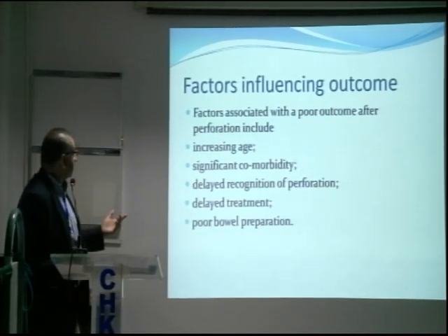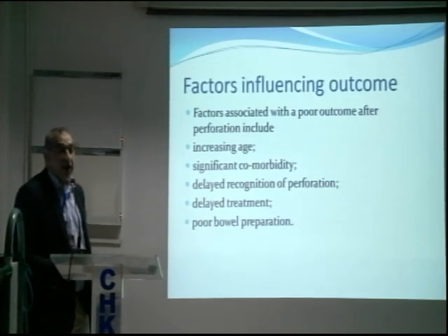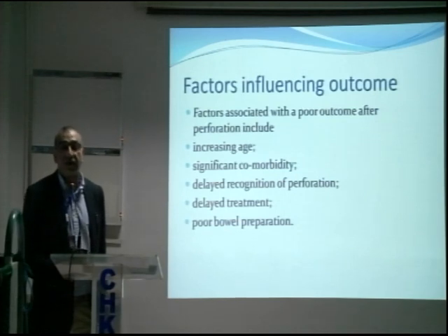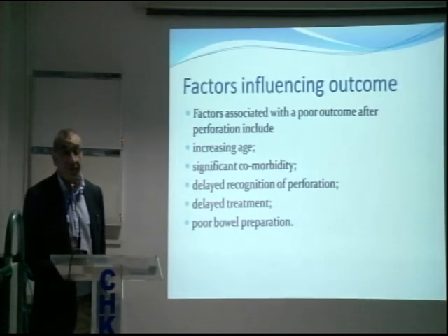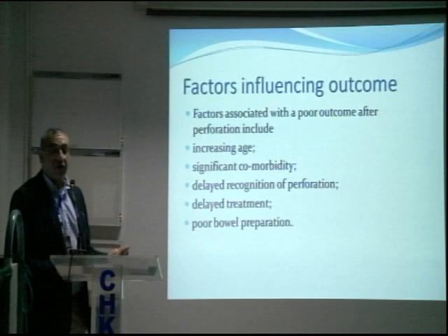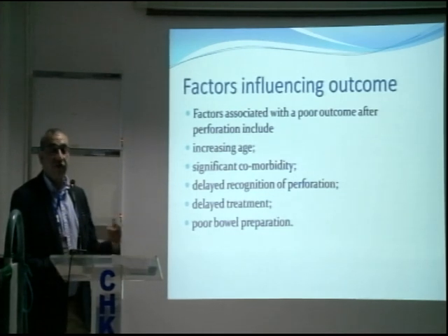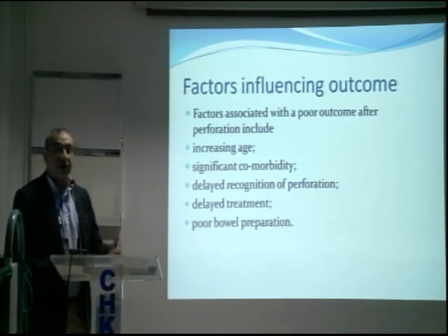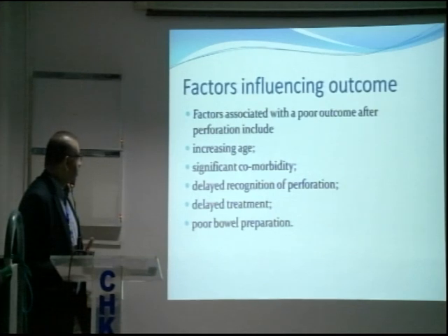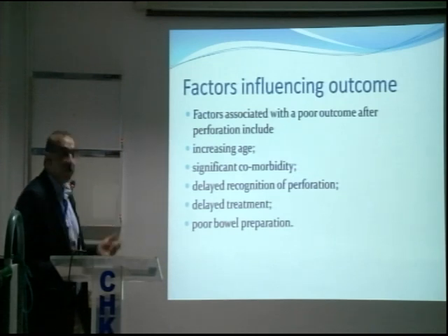If you get a complication, like a perforation, what can make the outcome worse? Like anything, increasing age is always a bad prognostic factor. So if you cause a complication in a 90-year-old, the prospects are going to be far worse than if you cause it in a 30-year-old. But no one would excuse you for causing a complication in a 30-year-old. Significant comorbidity. Anyone with comorbid factors like COPD, ischemic heart disease, hypertension, diabetes, chronic liver failure, they would have a far worse prognosis. And another very important thing is delayed recognition of perforation.